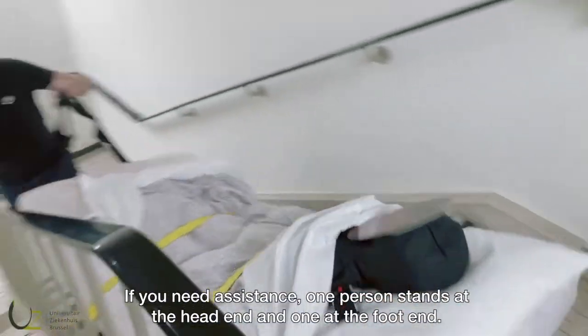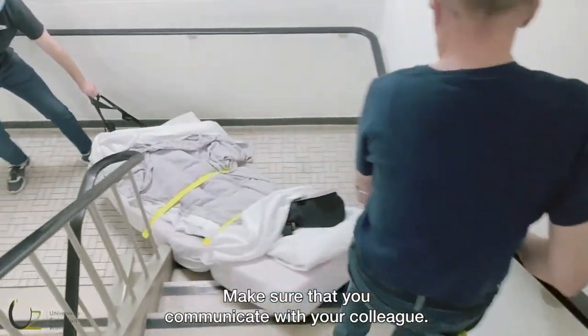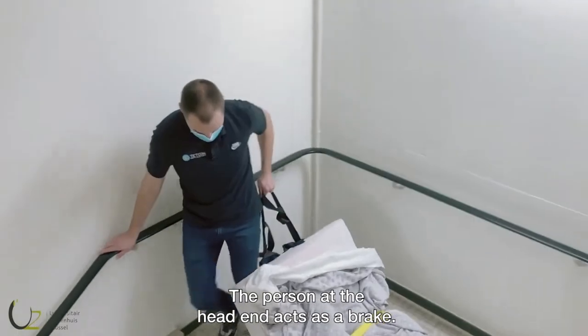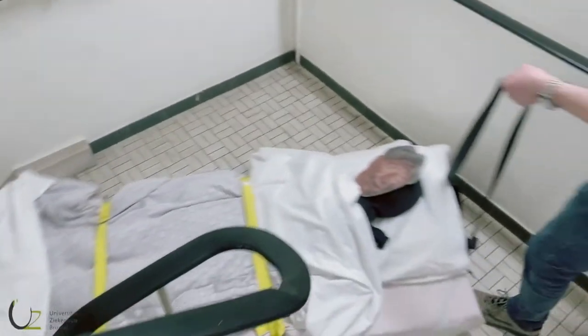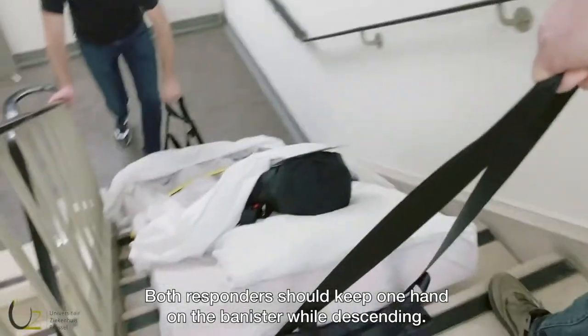If you need assistance, one person stands at the head end and one at the foot end. Make sure that you communicate with your colleague. The person at the head end acts as a brake. Both responders should keep one hand on the banister while descending.